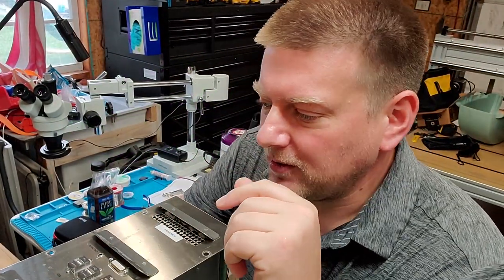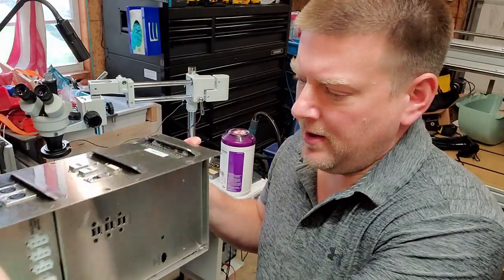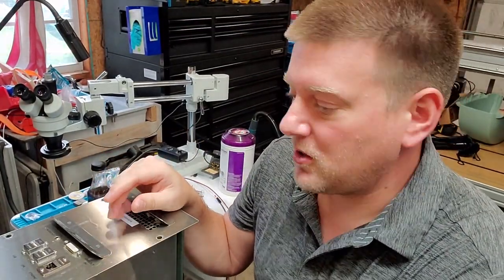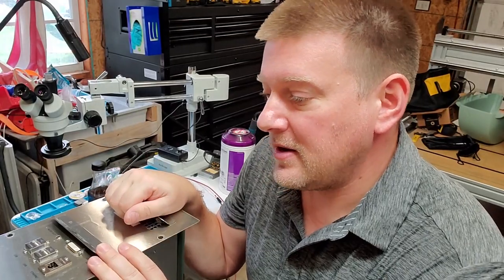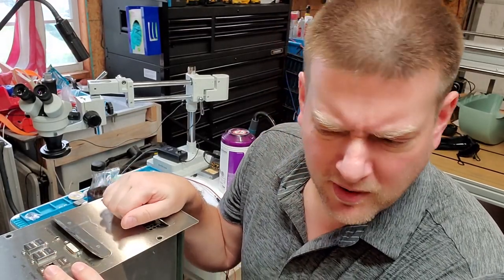Today I'm going to do a couple little teardowns. One of them is going to be on this PC unit right here, which is a little bit heavy. It comes out of a scope washer, a Medivator scope washer. They said that it's got some random anomalies, just randomly, it has different problems. So we're going to open up, we're going to take a look.